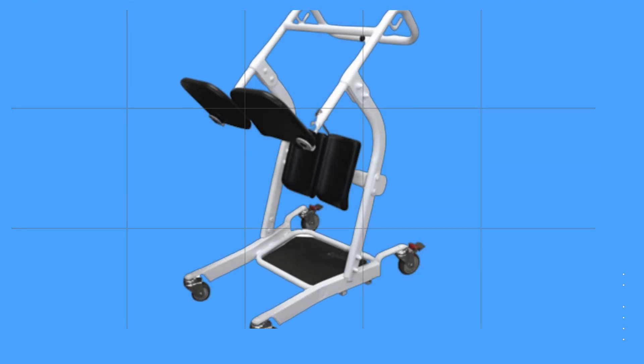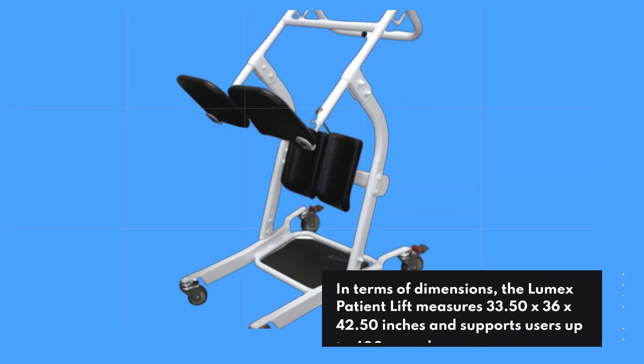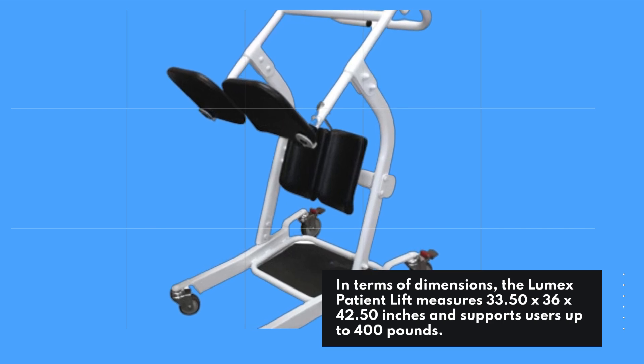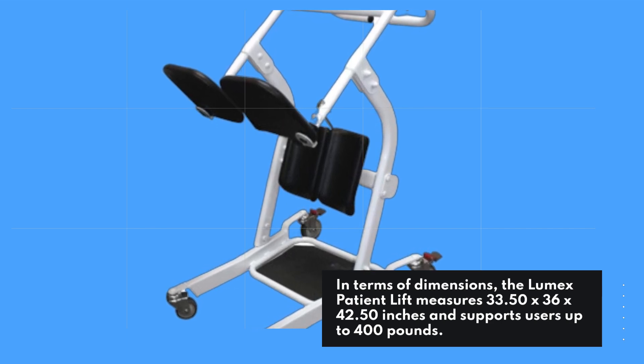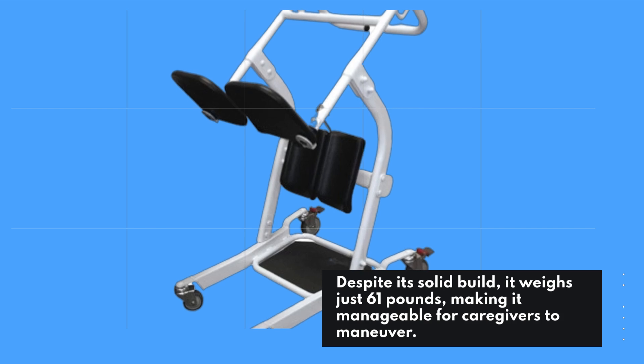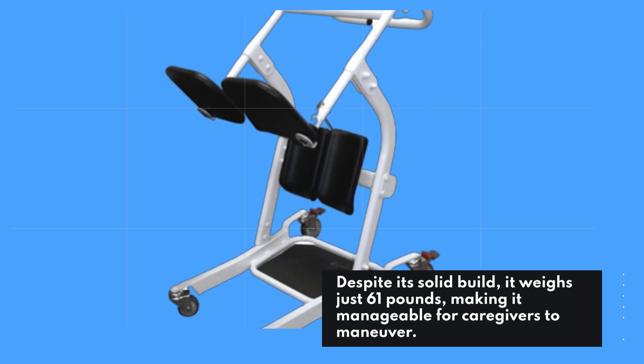In terms of dimensions, the Lumix Patient Lift measures 33.50 x 36 x 42.50 inches and supports users up to 400 pounds. Despite its solid build, it weighs just 61 pounds, making it manageable for caregivers to maneuver.